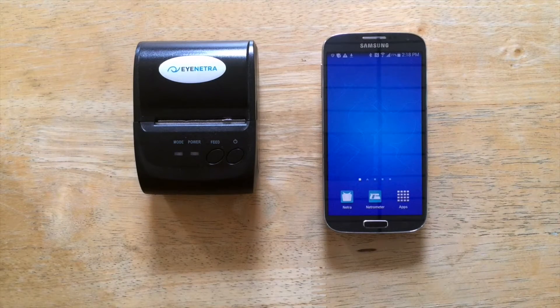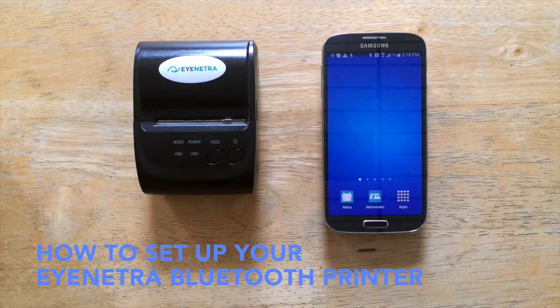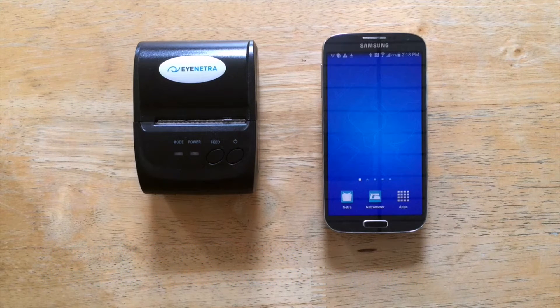Hello everyone, Greg here from iNetra. Today we're going to show you how to set up your wireless Bluetooth printer. In order to print the results from your iNetra phone, you must first pair the printer to the phone via Bluetooth.